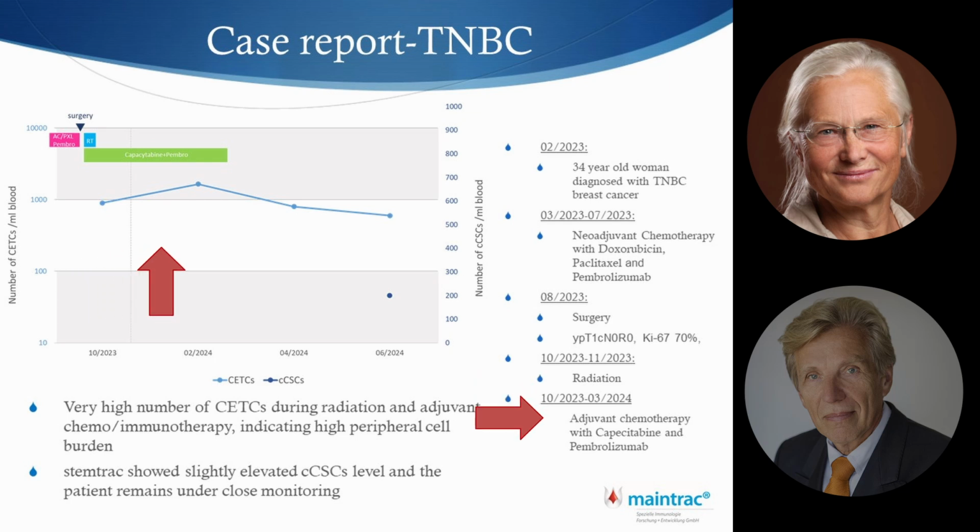She then received pembrolizumab with capecitabine. During this time, her cell numbers still increased, but they now do decrease after the end of the checkpoint inhibitor.